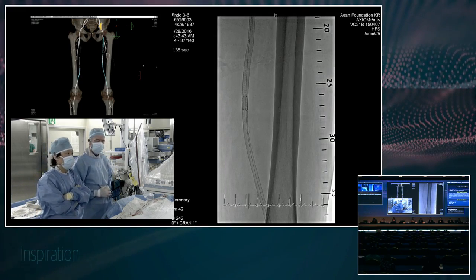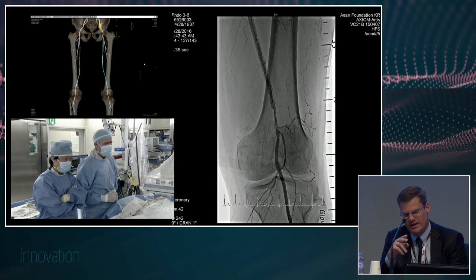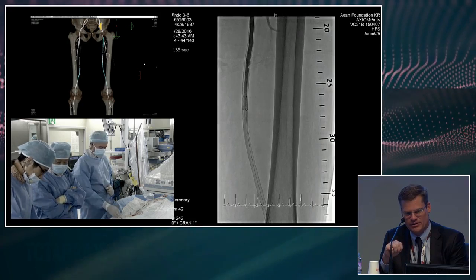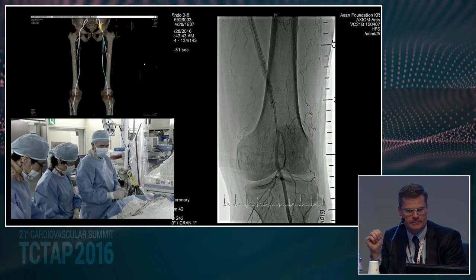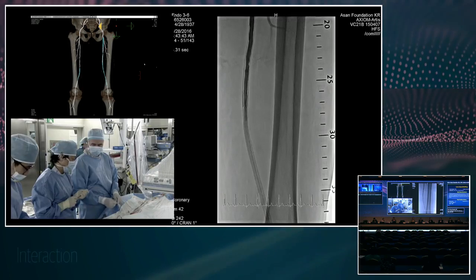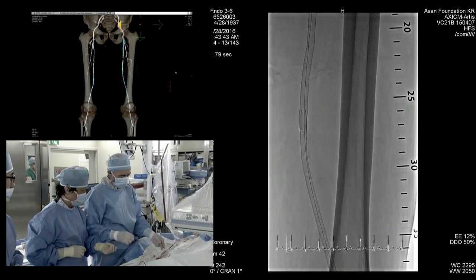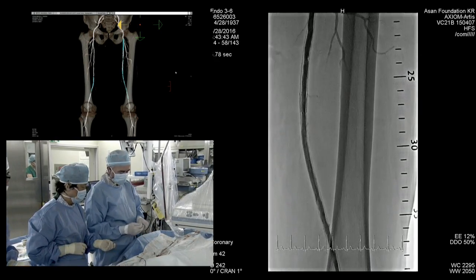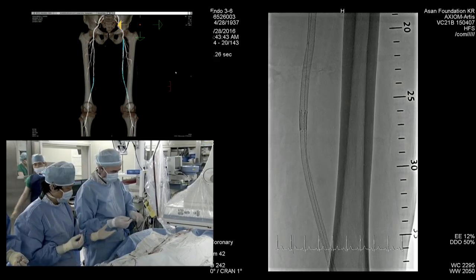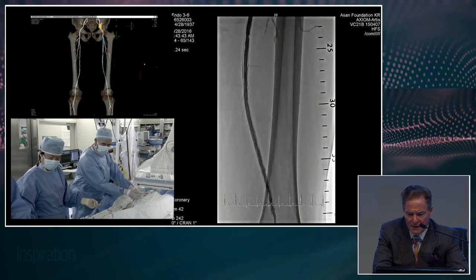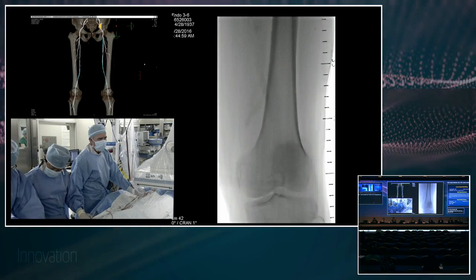I would tend to leave it alone, but I'd extend a little bit further just because of the geographic mismatch — your balloon actually extended a little further out, and I'd prefer not to have to place another stent behind the knee if I could help it. George brings up a good point — you don't want to stent down there if you don't have to. It is a problem when you go across the knee joint past the adductor canal. Especially since you're dealing with a long stent column already, extending it to a very long length.